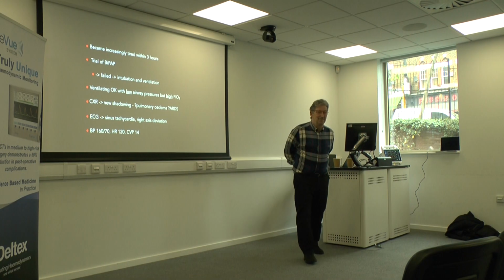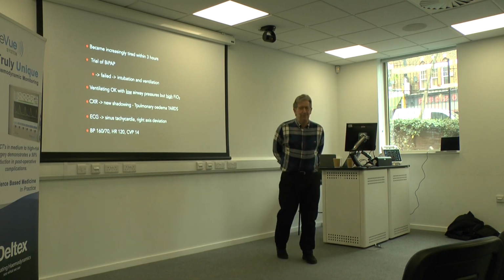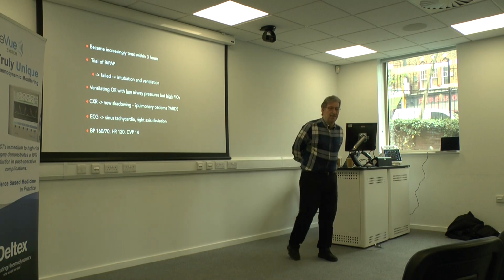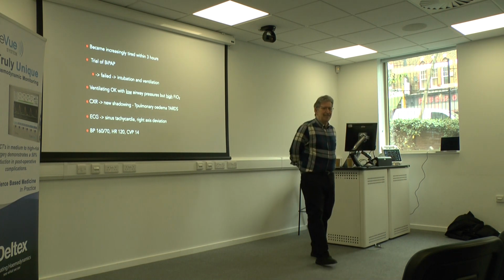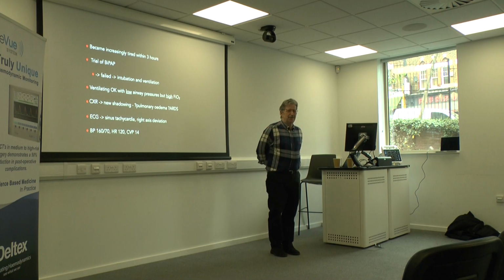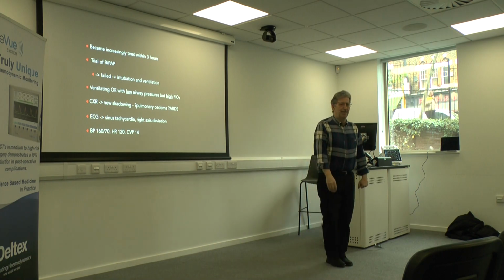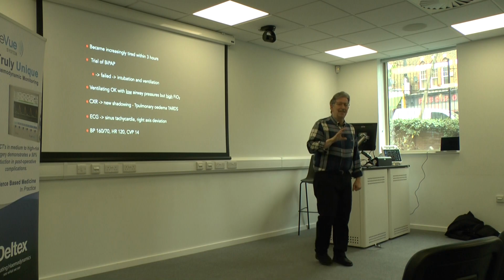Yeah, that's the problem. So I think POCUS in the right hand is brilliant. Unfortunately, the number of times people get it wrong. If it's done well by somebody experienced, then it's an absolutely great technique. I think, unfortunately, often, and I'm not good at it, so I don't claim expertise, the number of times you go, oh, this is what's going on, and then actually something else is going on.